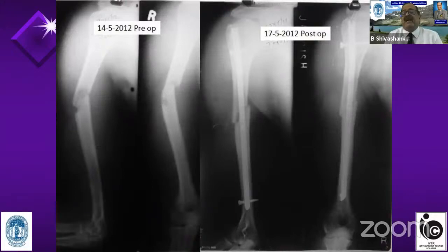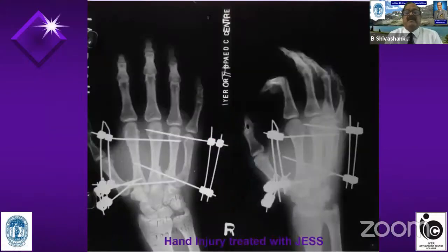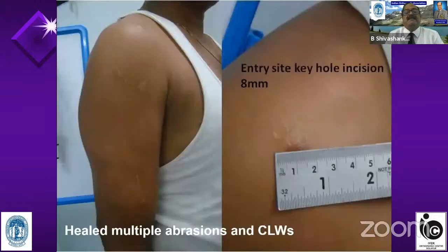This patient also had a crush injury of the hand, and after the nailing, he only came after 2 years. He has never come to me for follow-up. So comfortable he was. This crush injury I treated with an external fixator. At 2 years when the patient came, he had good function. See the incisions. He had multiple abrasions. You can see multiple CLWs which are sutured. So I couldn't have done plating in this case, definitely.